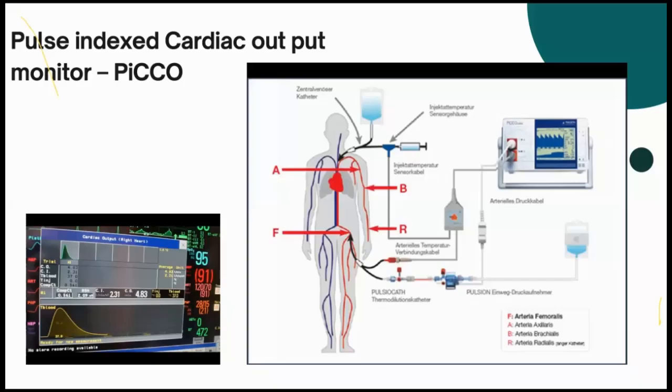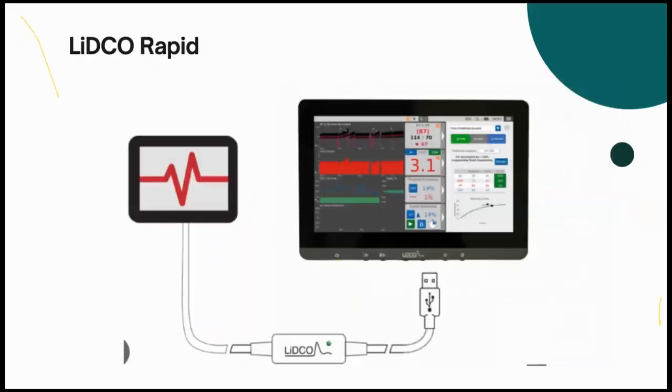This is the graph you get, and the area under the curve gives the cardiac output parameters. This is the cardiac output, cardiac index, and then many other parameters you can get from that. All these are shown on the monitor, and you can decide on more parameters that you can derive, like the lung water index, showing how wet your lung is, whether you have overhydrated and wetted your lungs. Then you can come down on the volume, right? So likewise, you can decide on the parameters that you are going to monitor.